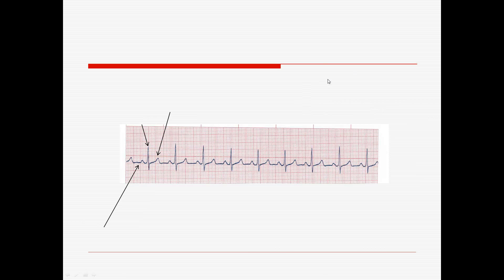Let's look at this one. Do we have a P wave in front of a QRS and a T? And does that follow through on each one? It looks regular — these look like they're nice and even. This is a normal sinus rhythm, normal sinus, because we have a P, QRS, T. What is the beats per minute on this one?